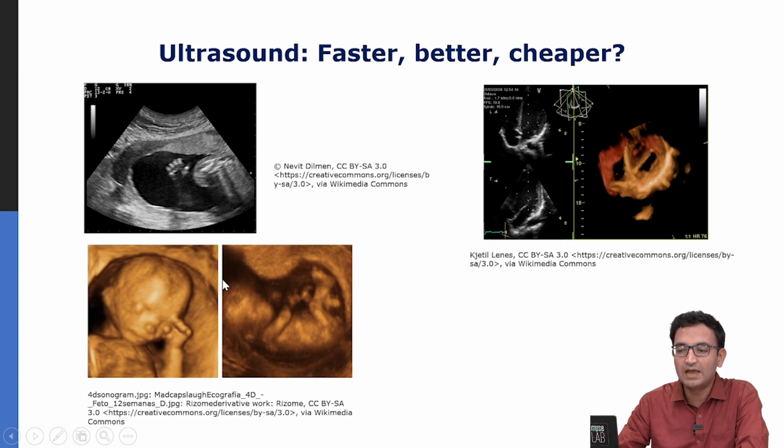And here is the 3D, and actually it's a 4D because this is a picture, but it can also be done in which you can see the live video of the fetus. You can see things like a fetus sucking on his thumb or even smiling. And so these are some excellent applications of the latest generation state-of-the-art ultrasound techniques.